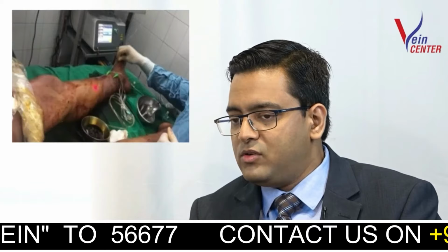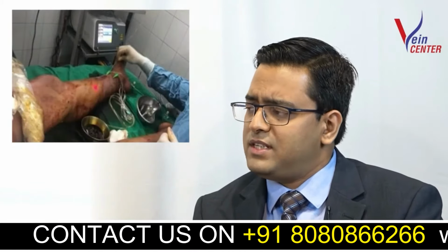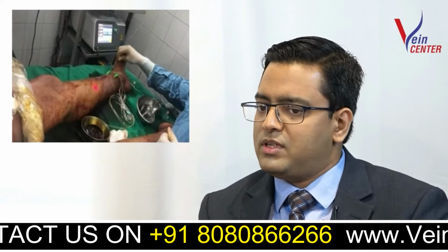Now procedures are done through a pinhole. Pinhole means putting in an IV line needle. If we have seen somebody with a saline being put on the arm, the procedures are done through such a small IV line needle. These two are now very much advanced.